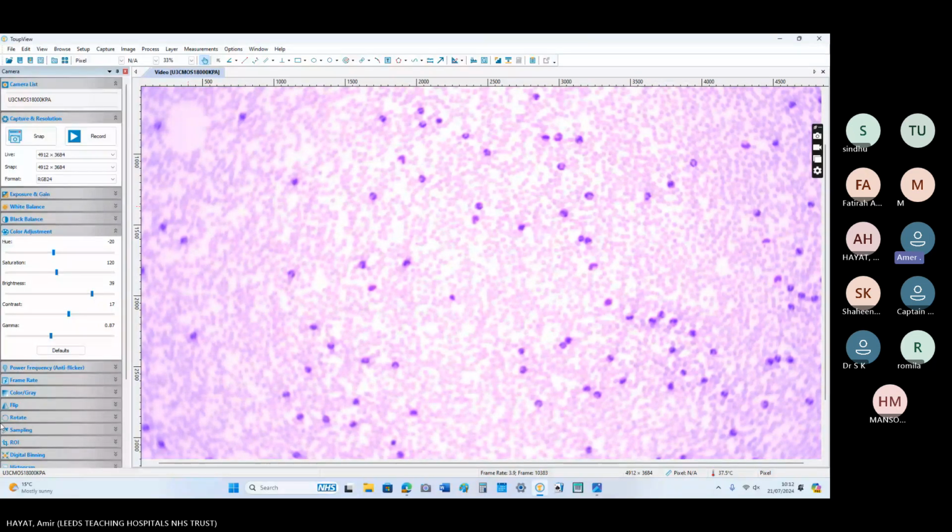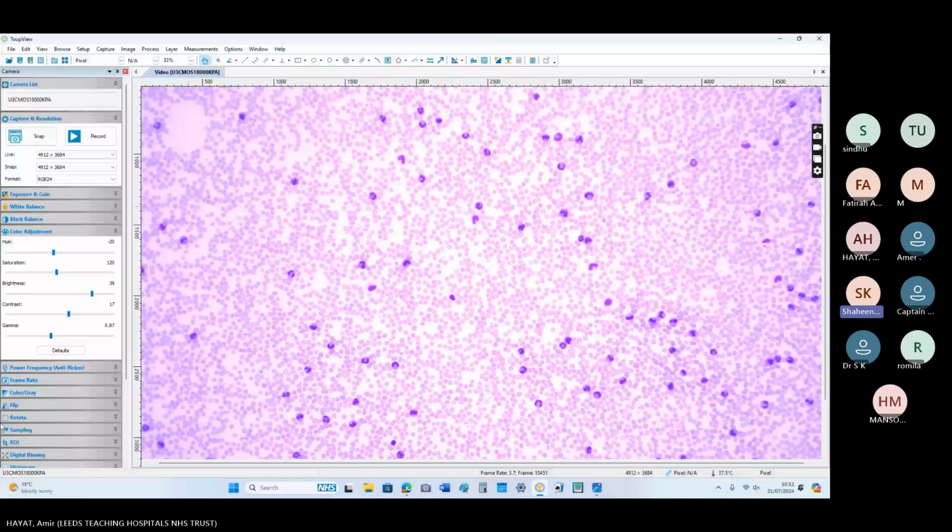Okay, so anyone for a third case? This was in the recent exam as well. Anyone? I will go then, if nobody's coming up.